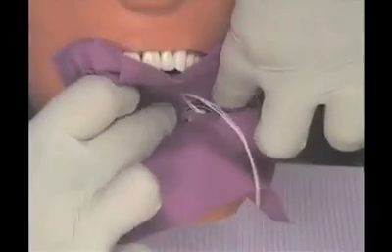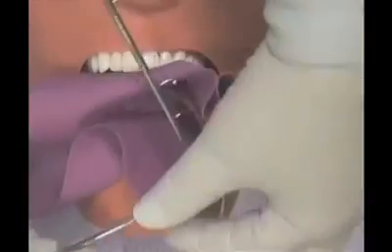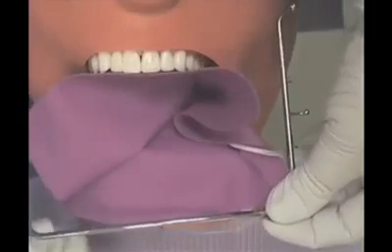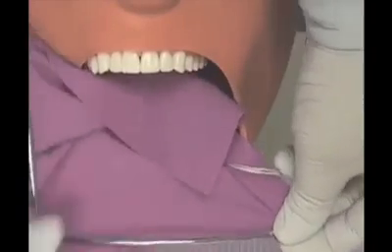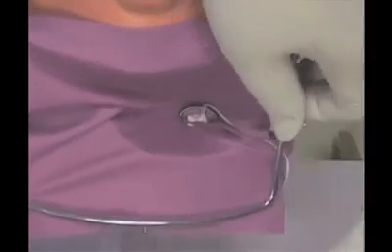Transfer the dental dam to the site and stretch the punched hole for the anchor tooth over the clamp. Position the frame over the dam and slightly pull the dam, allowing it to hook onto the projections of the frame to ensure a smooth and stable fit. This will stabilize the dam and aid in locating the remaining punch holes for the teeth to be isolated.